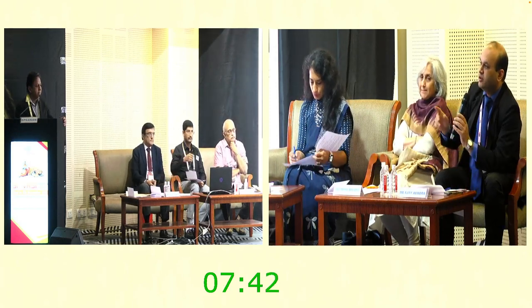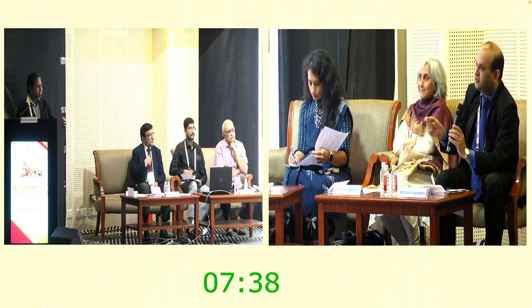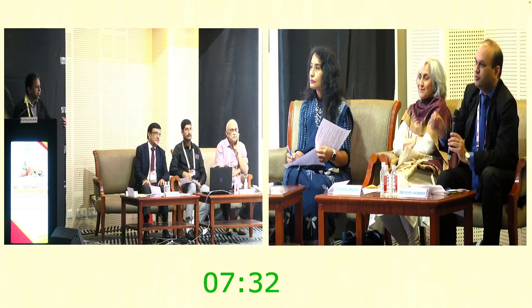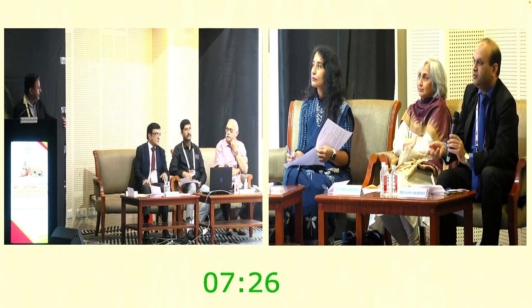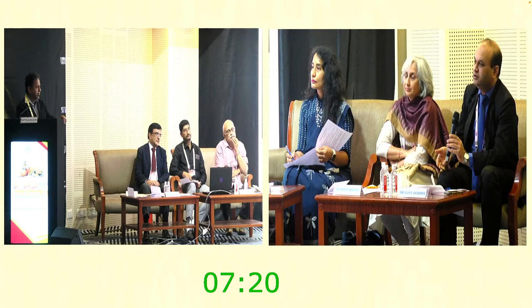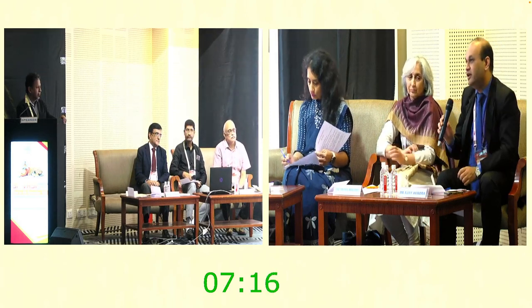Just one point. Thank you, sir, for the input. I have actually done what you said. I have taken a longer 26 gauge needle and curved it. I started using the needle only, and from the needle I modified it. But you are right in the sense that probably the device is firmer and easier for the membranes. Side cutting can be done with the needle also. In terms of entering and in terms of the plane, the needle also works well.